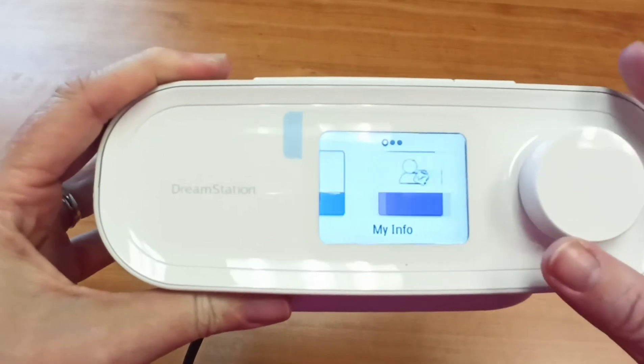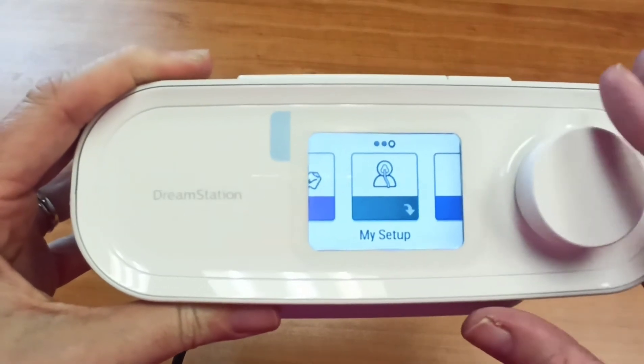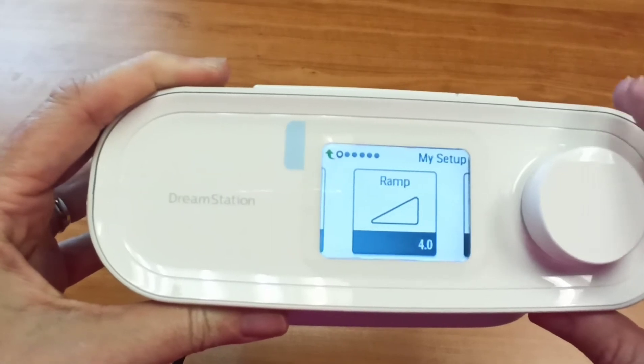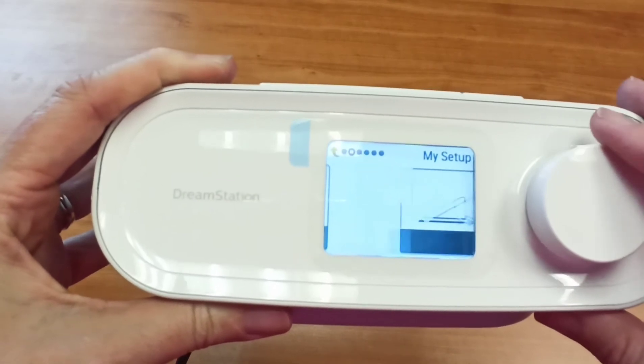So what if you don't like your ramp settings and you want to adjust them? You can turn your knob here and go to setup. You just give this button a push to open your setup menu. The first thing it shows you is your ramp pressure — this is how far the ramp drops. The second one is how long it takes to climb back up.